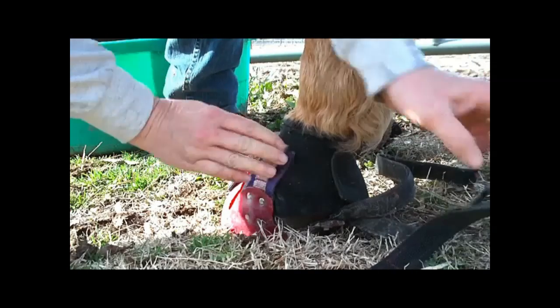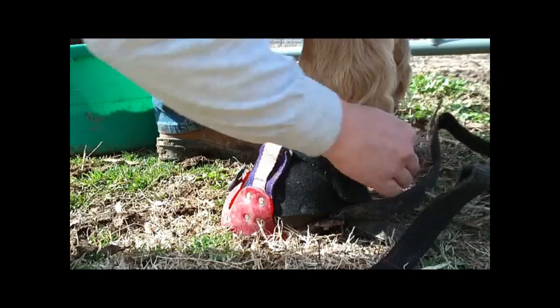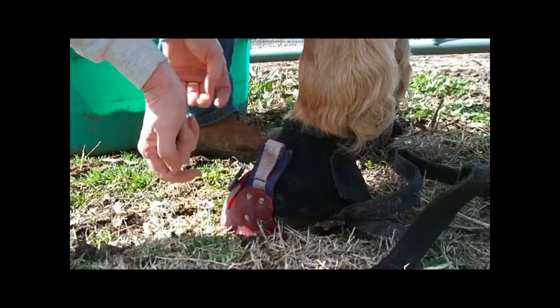Your side Velcro — toe up on either side, smoothing the neoprene belt down.